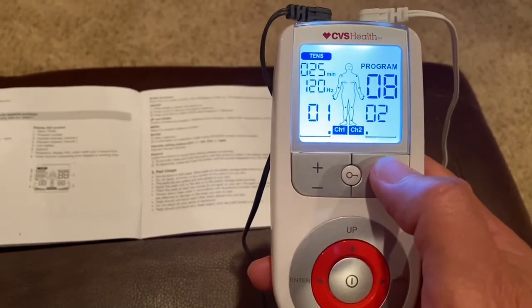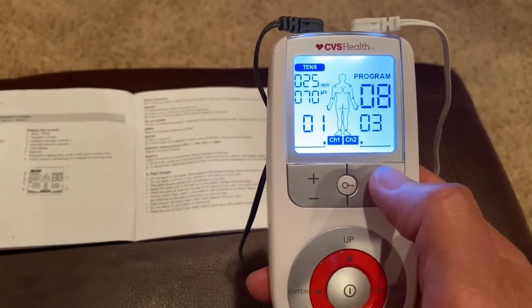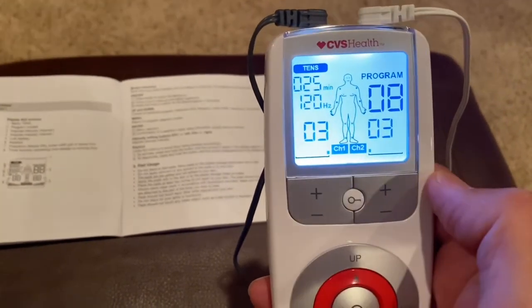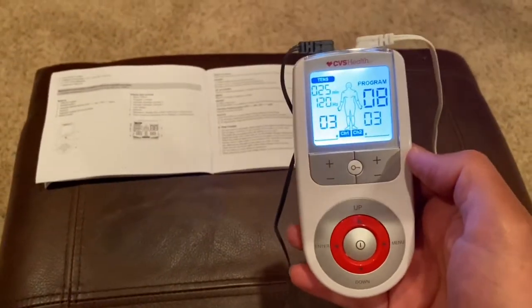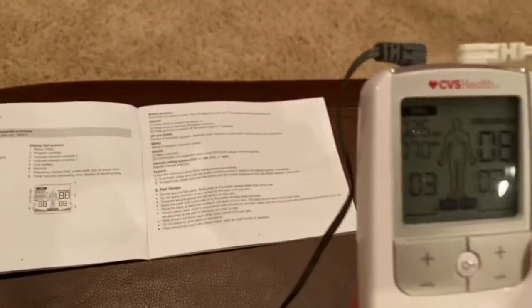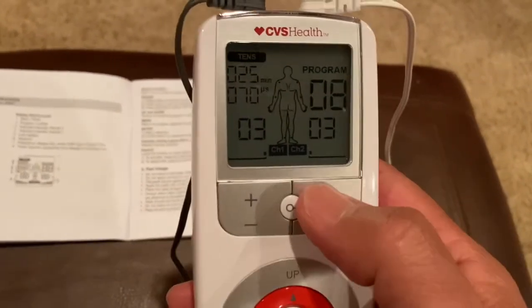I can begin to feel that on my shoulder now. Channel 2, I believe, is the white ones. And here we go with Channel 1, which is the gray pads on my shoulder. I'm going to try to show you my shoulder — I'm kind of doing this by myself, obviously. But that's a little bit about how you get it going.